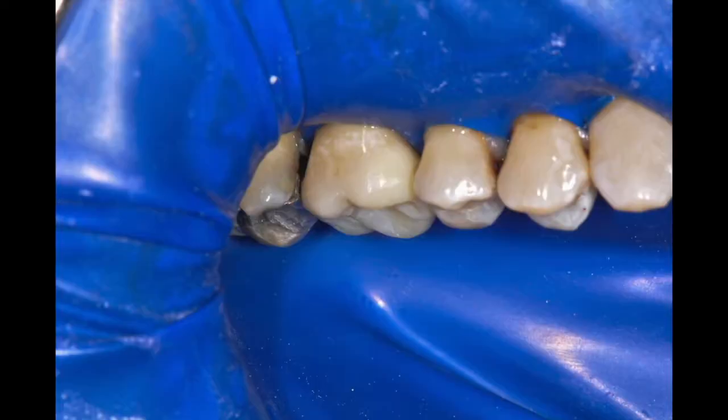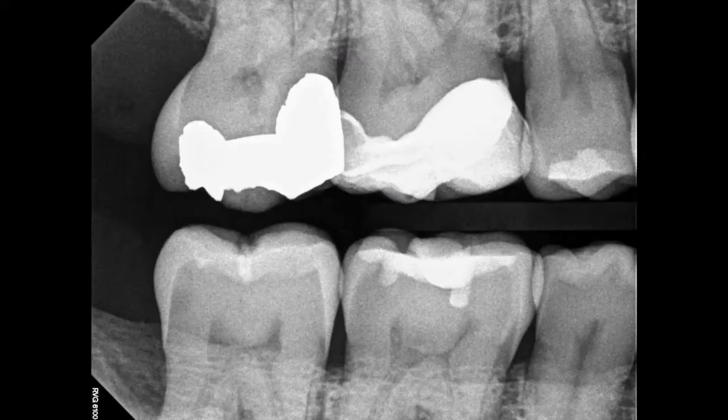The bonder was mixed with a dual cure activator before being applied to the tooth to assure complete polymerization during the cementation process. This restoration was cemented with a heated composite to increase the flowability and eliminate the possibility of a void or gap at the margins. The radiograph of the finished restoration exhibits closed, accurate margins and acceptable contour.